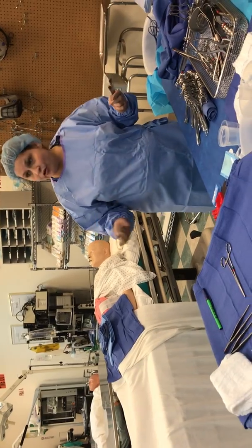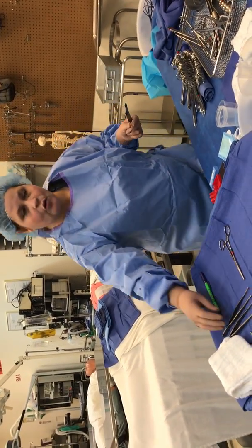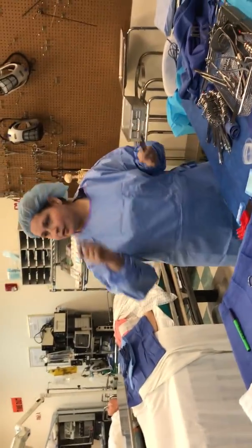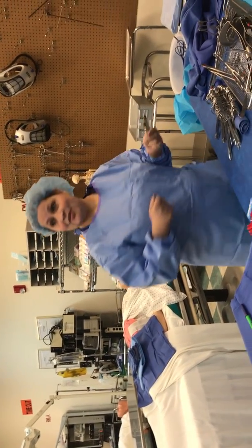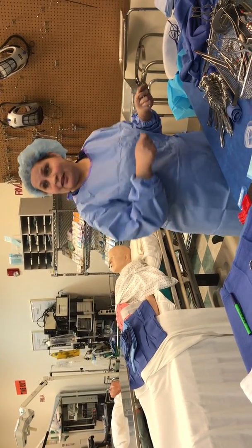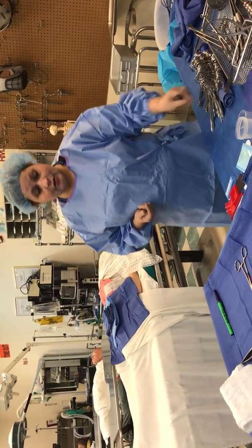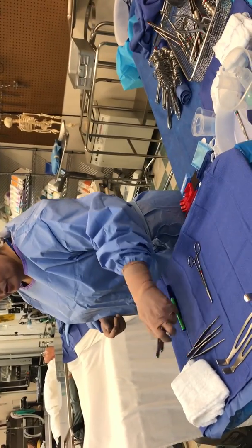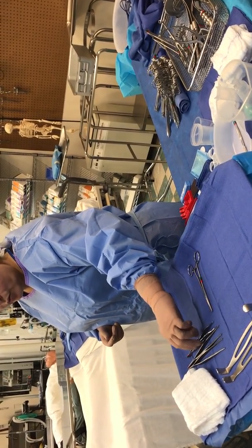So that's why it's important to always set up the same way. My DeBakeys are always on my right side. I'm right-handed, so I'm always going to grab what's to my right. I'd rather grab something that doesn't have teeth, and then let it not be, than grab something with teeth and, God forbid, he grabs it and makes a bleeder or makes a hole where it's not supposed to be. Okay? So those are the things you guys have to be aware of.